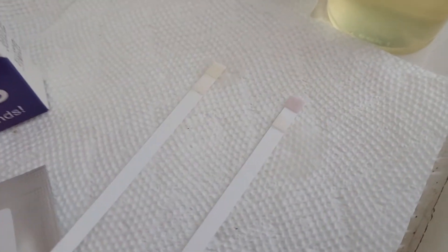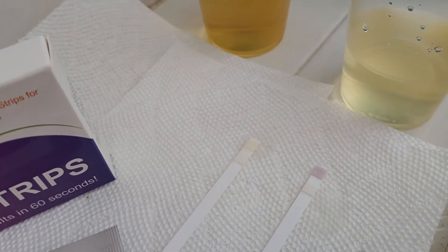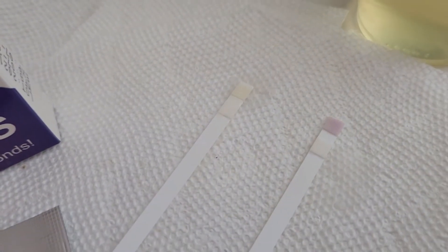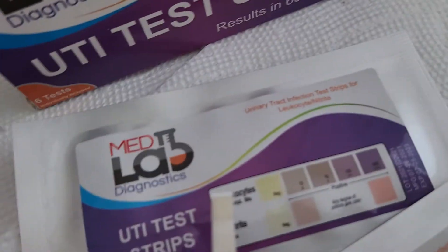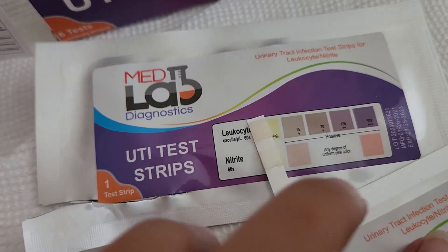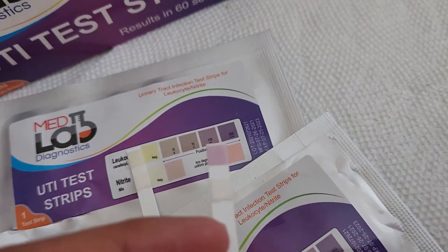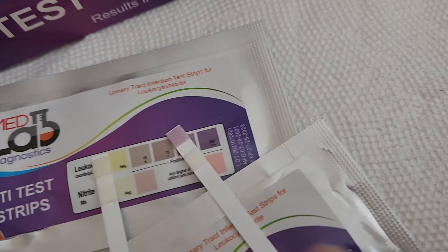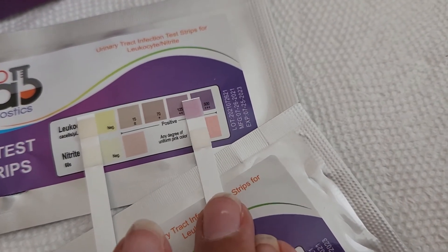The second sample looks like it's going to be a positive result for a UTI and the first sample is going to be a negative result. We can go ahead and compare that to the little color chart. You can see that this is the negative result here, and then the positive result — that's very positive. It looks like that one is going to be at about the two plus mark.